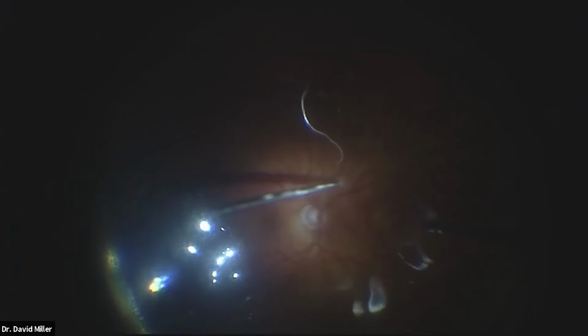And we don't have that problem here. You see it only with an open capsule. His capsule is open, but he's not condensing on the back of the IOL. It's due to the temperature differences between the chambers of the eye, posterior to the anterior. And you can deal with it if it's problematic, either wiping it off with the soft tip. It works for maybe a minute or less.